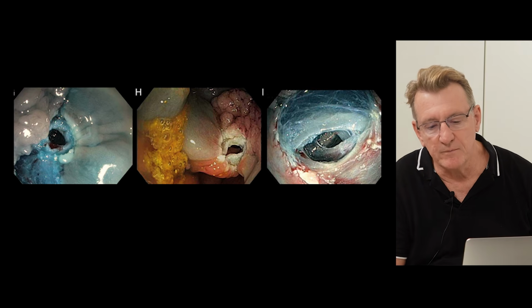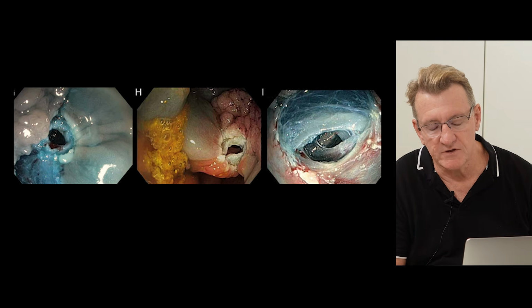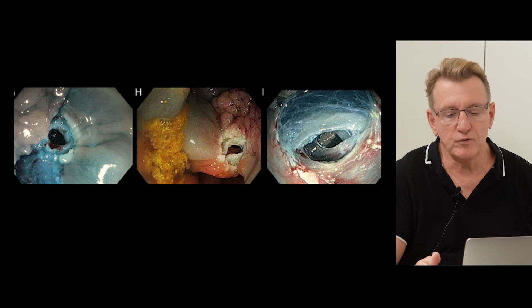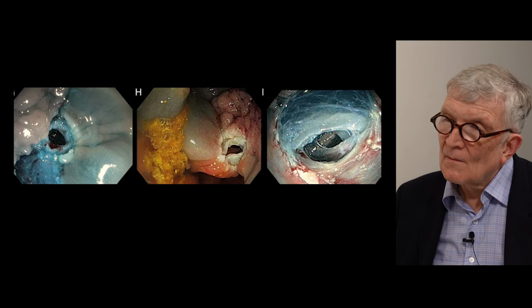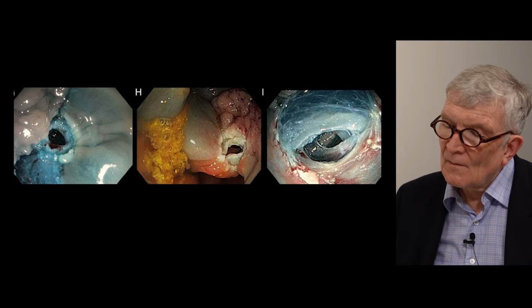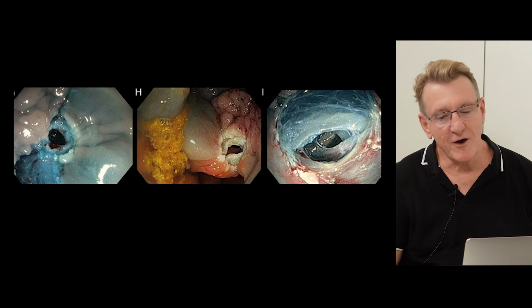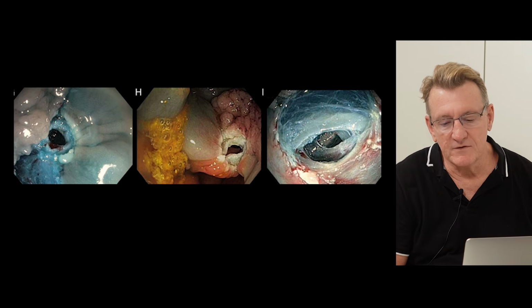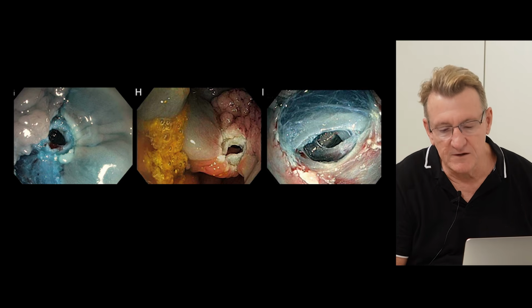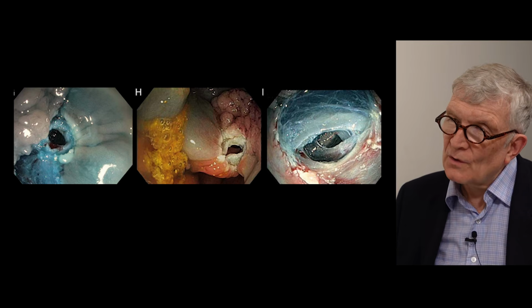But in this example down here, we would resect the adjacent tissue, and provided the patient was stable, which they generally are, and the fluid pool needs to be opposite the hole so that you're not going to contaminate the hole. And we always give Buscopan as well, because hyoscine, because sometimes you can get a bout of motility that'll sweep the scope away from the hole, and that's a real problem. So work efficiently, resect the adjacent tissue, and then close the defect. That's another very important message.